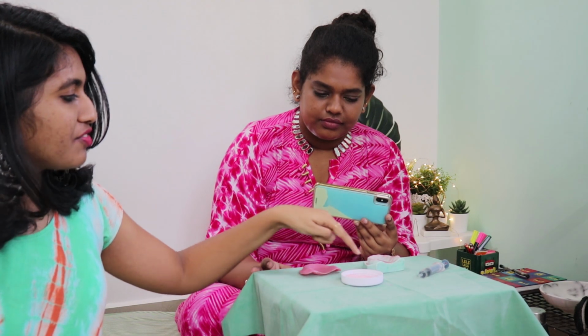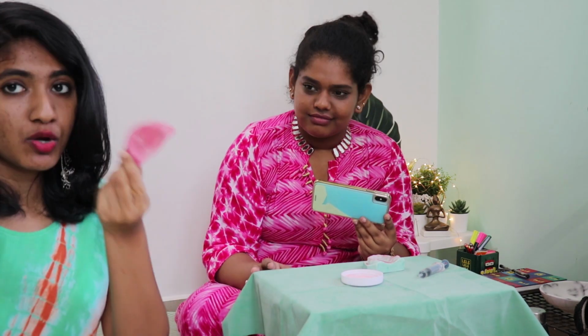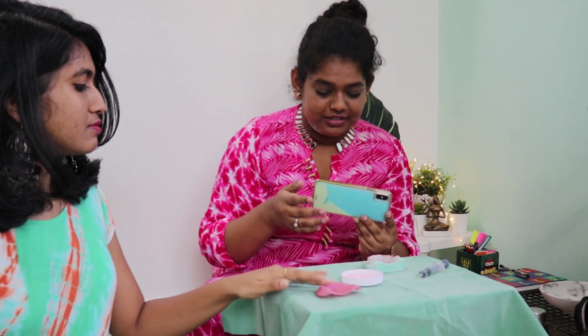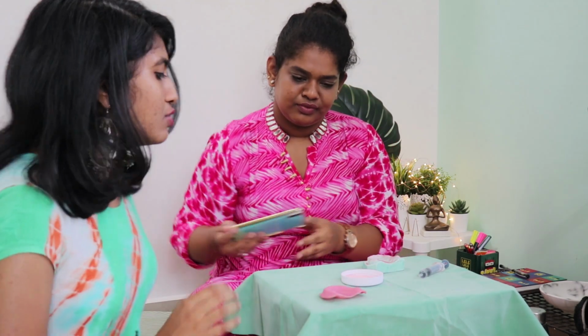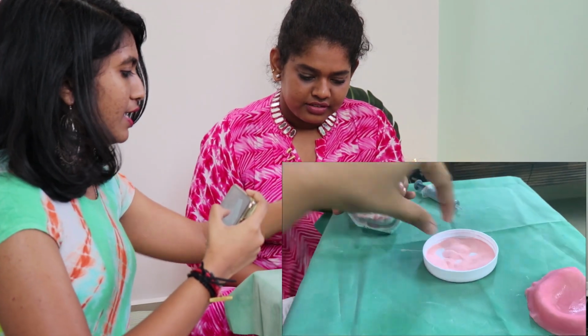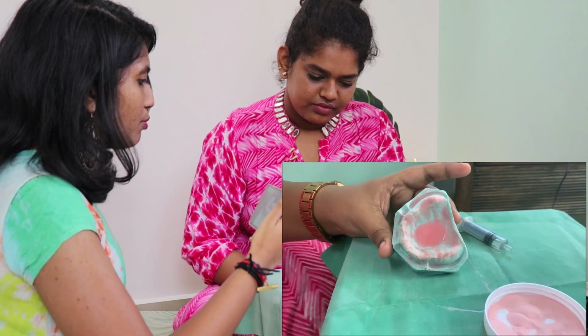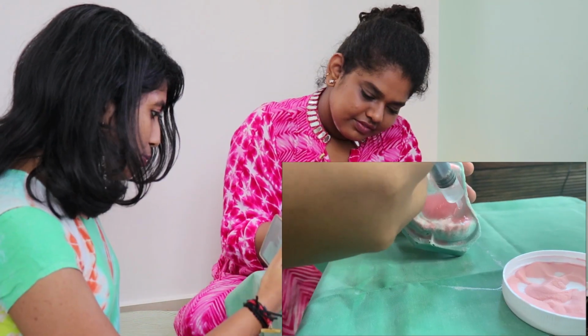I'm going to make her do a little more, covering as much of the eye as she can. It's difficult to carry this, but we can try. Sprinkle the powder here while holding it, and pour the liquid. Fill as much as you can.